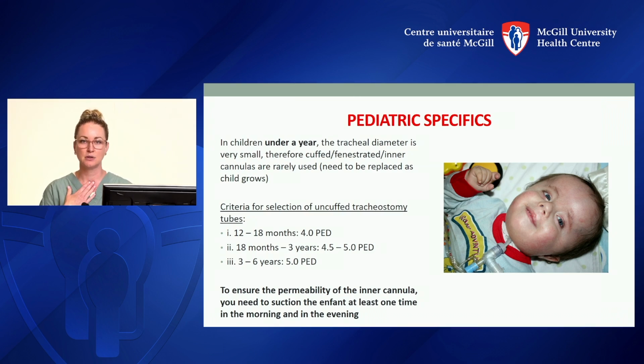That will cause air leaks around the tracheostomy, despite the presence of a balloon. So if their cuff is inflated and you start to hear an air leak or air around, that should be a signal that maybe this child needs their trach to be a larger size. And generally, adolescents over 12 years old and adults who have reached their maximum physical development don't require replacement of the inner cannula for a change inside. They will just require their usual changing of the tracheostomy tube.